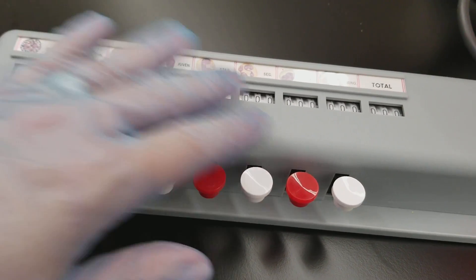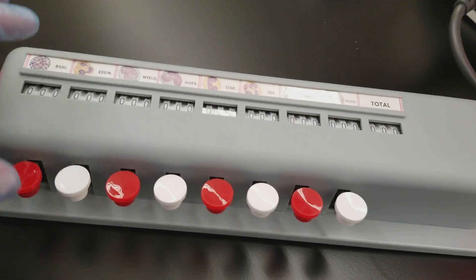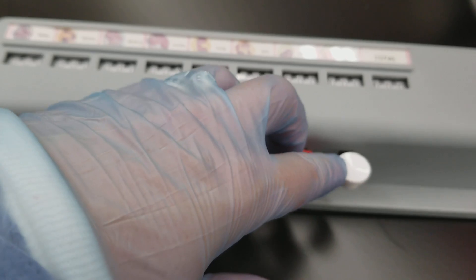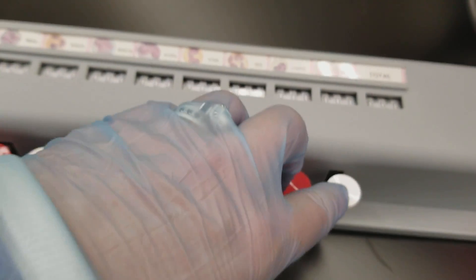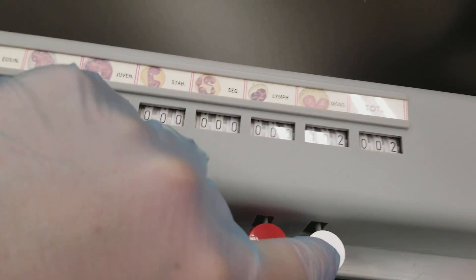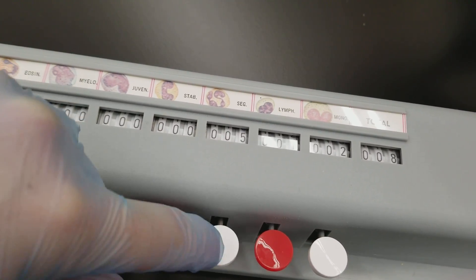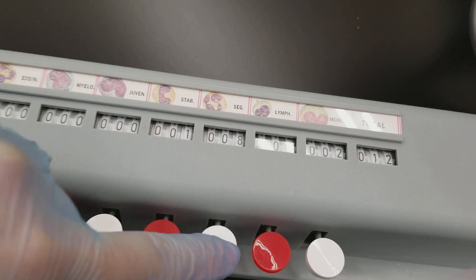So you can move these around if you wanted to. But when you're going through and you're scanning, you're going to be hitting whatever cell line it is that you're seeing. Obviously, you should be seeing more neutrophils than anything else.